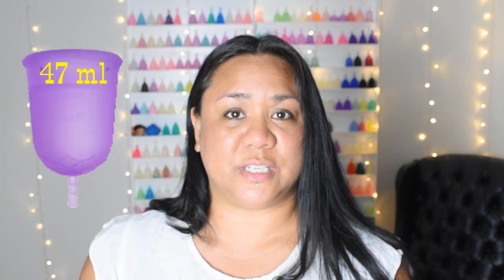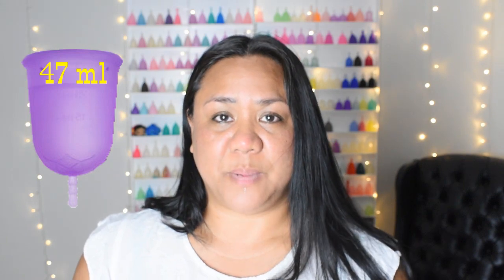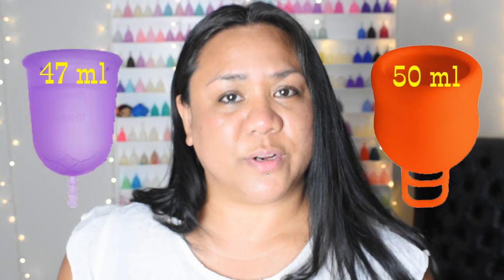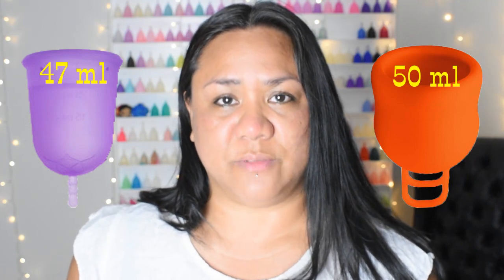The large Venus Cup has the second to the highest capacity with 47 milliliters to the top of the rim, only being beat out by the Marula XL with 50 milliliters. However, the Venus Cup was able to achieve that capacity while still being within the average size and width. It's also about a medium firmness, or slightly to the softer side of medium depending on who you speak to.